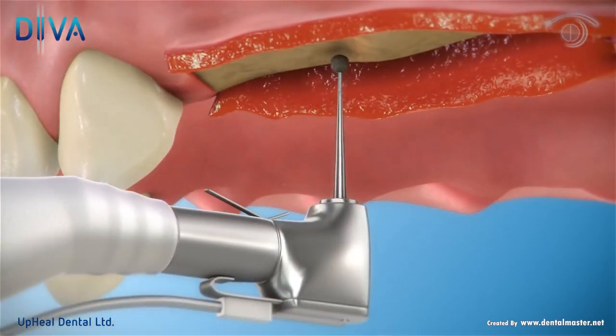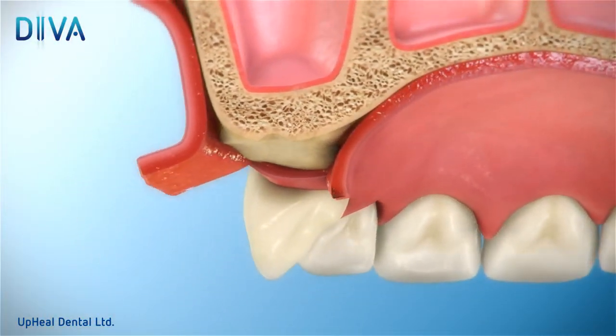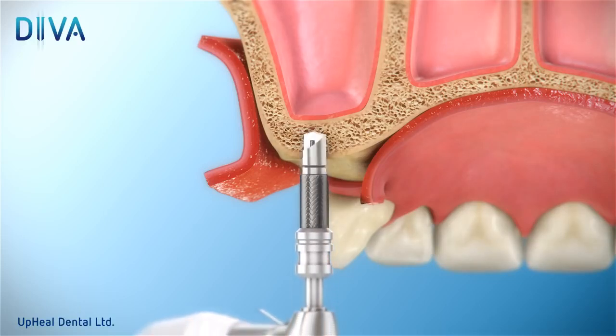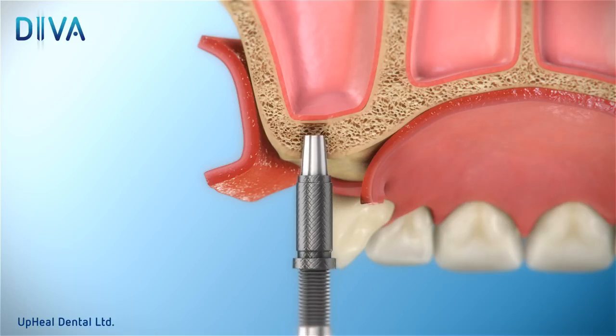Start by using the round bur to indicate the exact location of the implant. Begin drilling with a pilot drill until a depth of 1 millimeter beneath the sinus floor. It's best to use a drill stopper to achieve the correct depth. Now insert the special concave osteotome into the drilled space and gently apply pressure until the first crack of the sinus floor cortical bone appears.